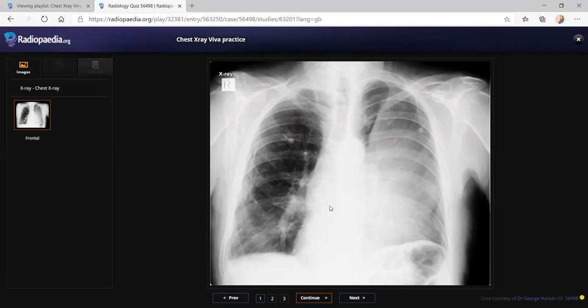So I told you that it's a 50-year-old smoker. So you have to repeat that history. And in a 50-year-old smoker, we have to think of the possibility of any malignant lesion causing compression or any obstruction of the left upper lobe bronchus and causing collapse. So with this patient, you will compare the previous film to see whether it is acute or chronic, and arrange and inform the referring clinician and refer to the chest MDT and arrange for a chest abdomen and pelvis CT.